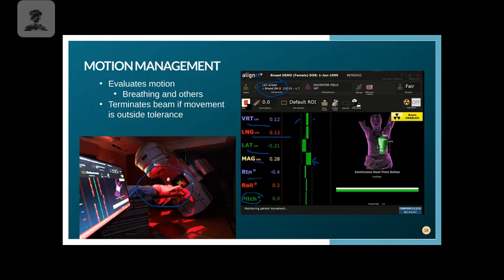So we typically do these with left breast patients. We'll do them with lung cancer patients. I've actually seen a lot of them moving into treating anything in the GI region or even in the pelvis, just because they have it. So why not use this fine tuning skill that also can prevent additional exposure to healthy tissues. So a lot of people are using it all the time.